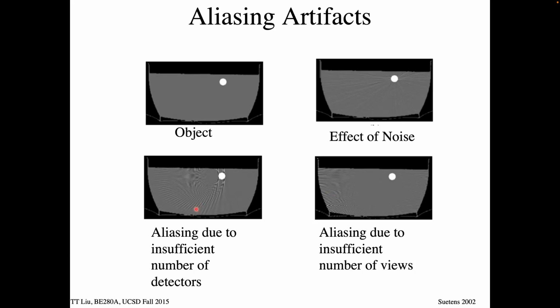If, on the other hand, you have an insufficient number of detectors along your detector element, so if we reduce those numbers, then the ability to place an edge at a specific location gives you artifacts that come off of those edges and spray back into the object. This artifact is classic when you see it coming off an edge. It's not far away from the edge. Over here, we're a long distance from the edge. This comes right off the side of the edge.